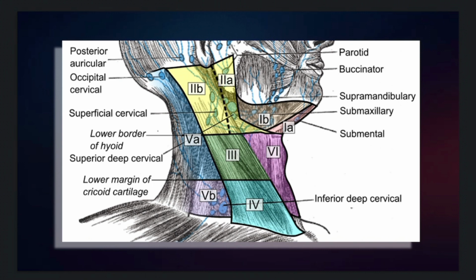For the most part, the neck is just going to be from the mandible down to the supraclavicular region. If the patient has an ultrasound indication for like a scalp lesion, you can focus on just that lesion. But when we're doing the neck, I do the entire neck.